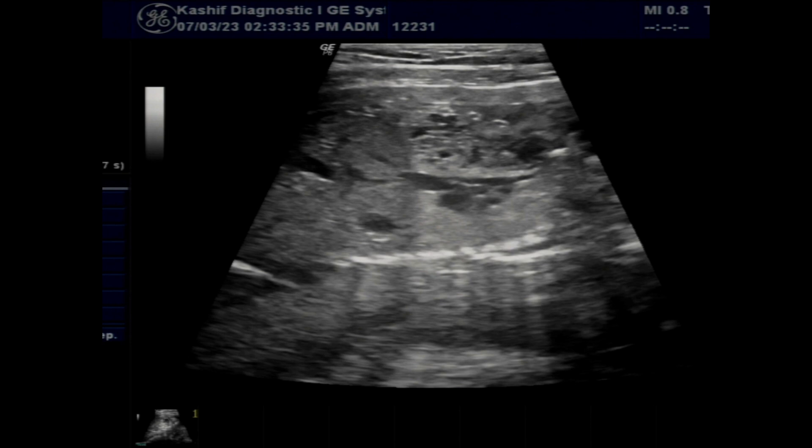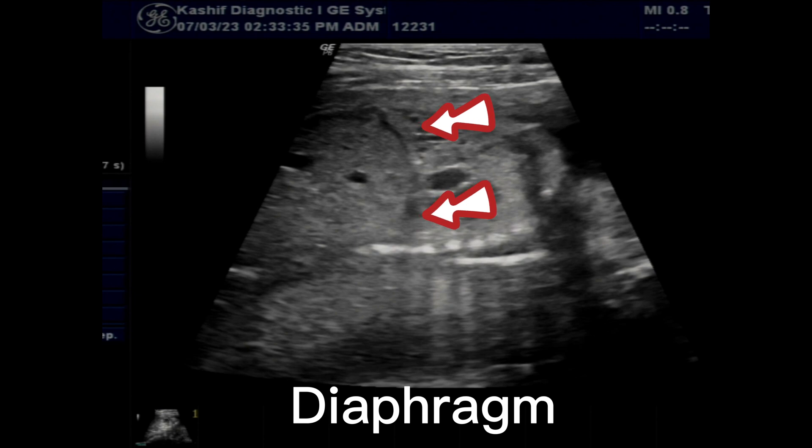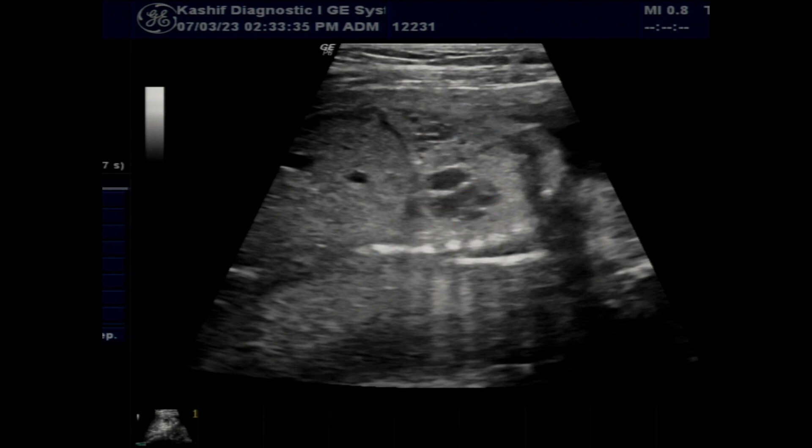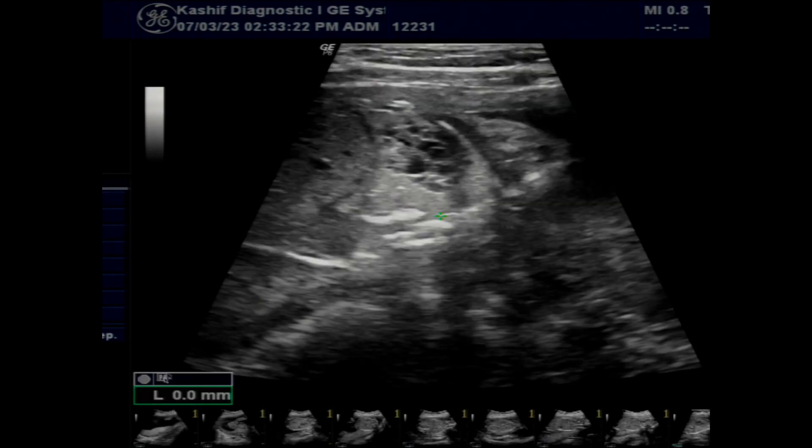The stomach is normal in position. It also shows that the lung cystic lesions are on the right side. Another longitudinal view gives a clear image of the diaphragm. The diaphragm is normal and there is no sign of herniation of stomach or small bowel loops.